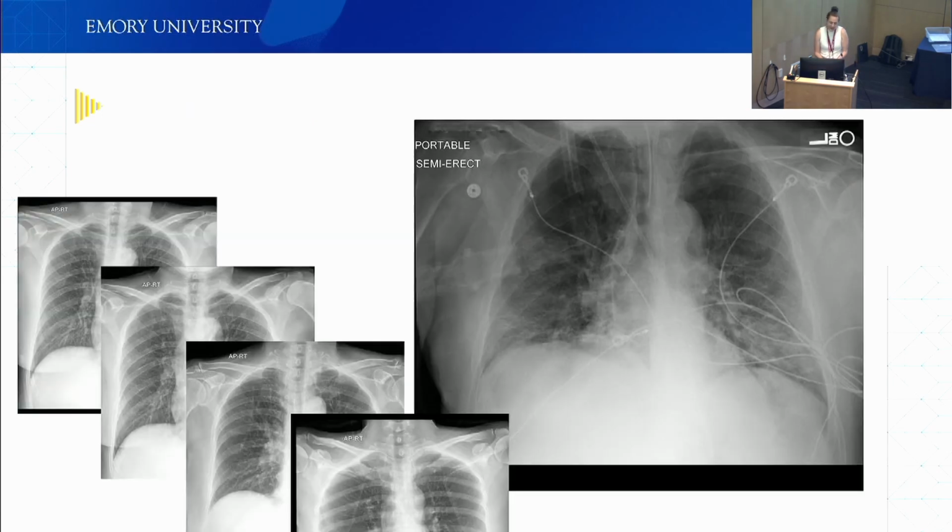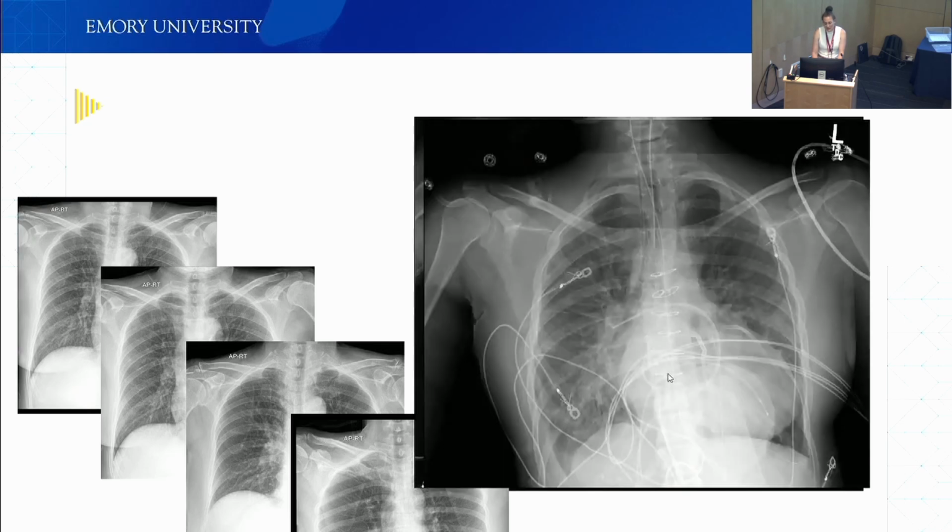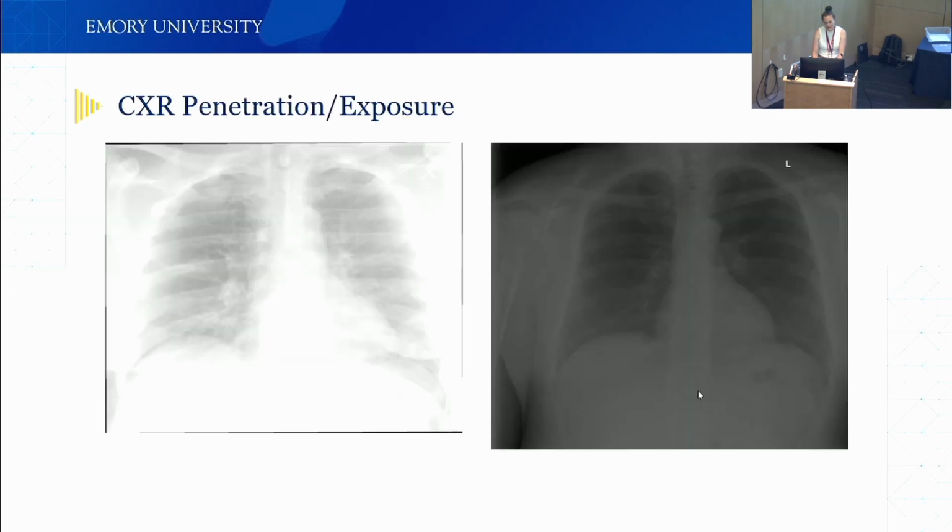So again, if you have normal cases here and you try to predict pneumonia or outcome, and here this is an intubation tube, it just matters. This one, you see the whole ventilation machine on there. Here you see the bypass wires. Just something to take into consideration when you make your databases.